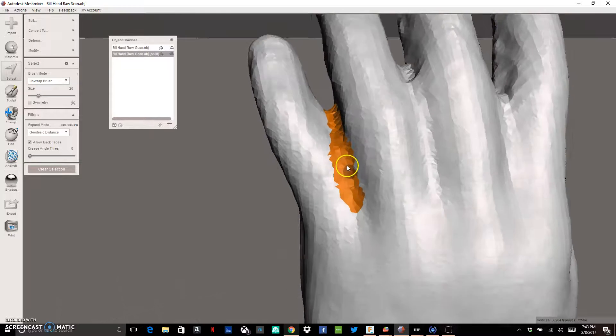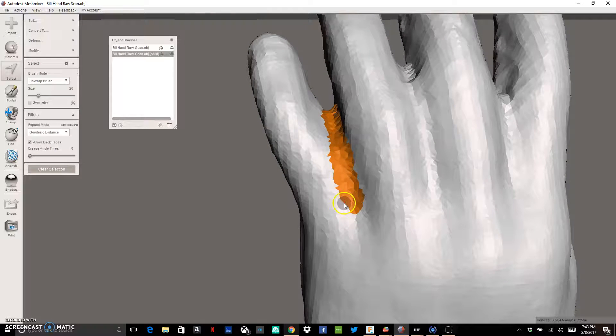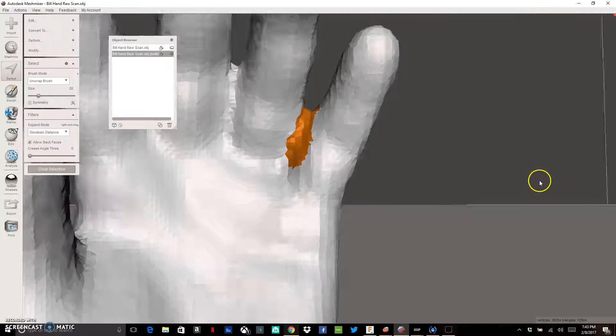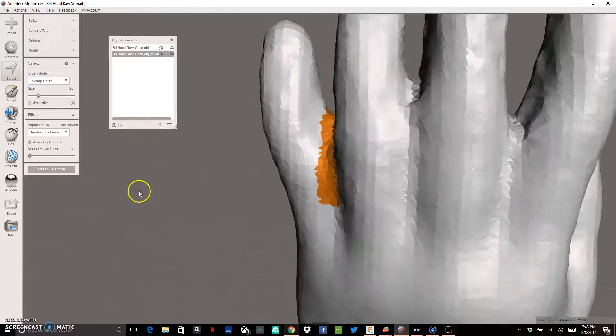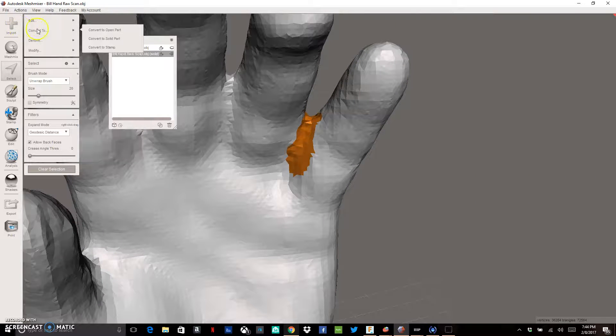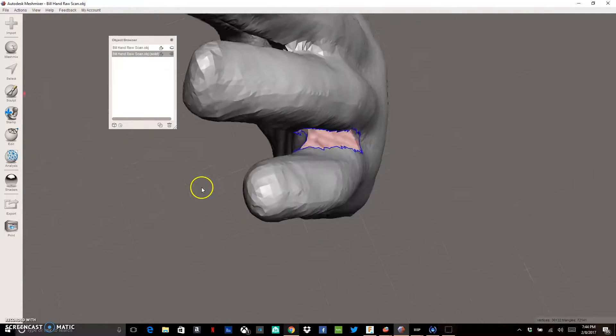I've probably gotten rid of a little bit more webbing than I want towards the bottom, so I want to select a bit more at the top. It'll highlight that. You can hold down the Control button and click to unhighlight areas — if I was too aggressive with some webbing down here, holding Control will deselect those areas. Pan around to check what you're getting rid of.